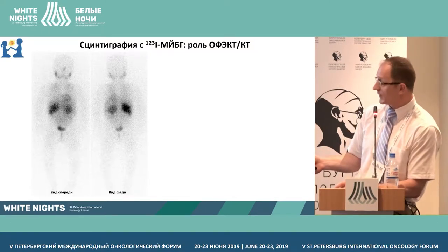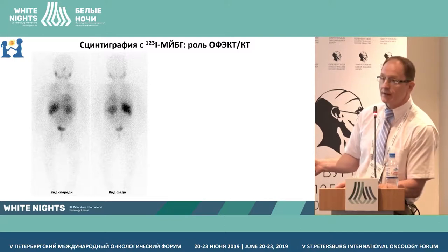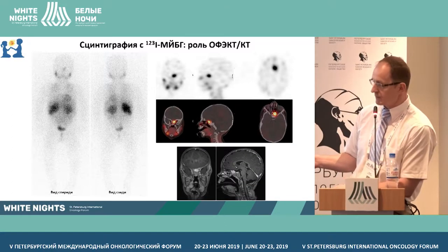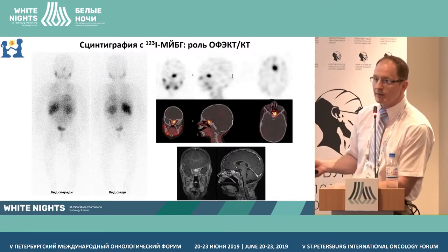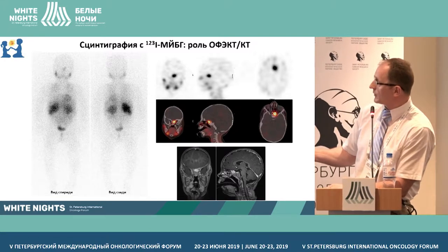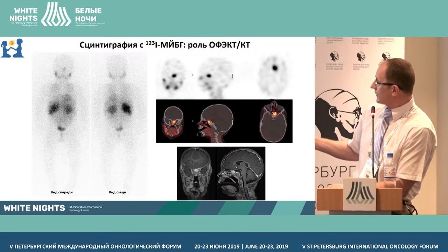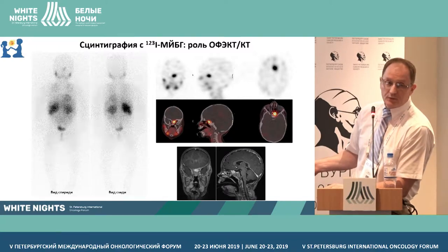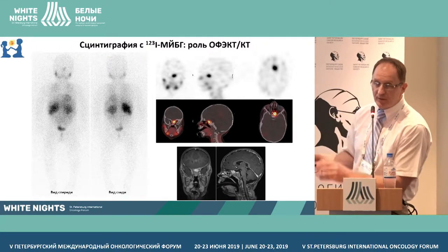We have bilateral lesions in neuroblastoma and to first view no metastasis. However, after targeted lateral projections of the head were performed, we see this uptake that is concealed on the planar image behind the uptake in the mucosa of the nose. This is SPECT/CT, and this is nothing else but a lesion of the skull bones, which we also see on MRI.